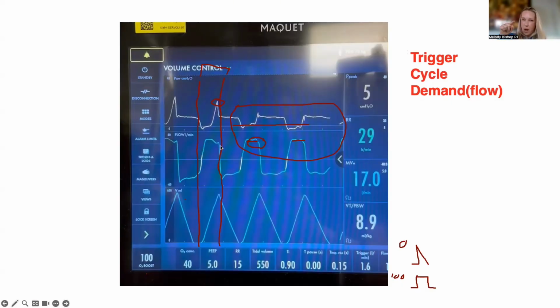Because to me, if it's a square and all of a sudden our flow is notching down, it could be because the patient is actively exhaling, decaying. Technically, I hate to say the word vector, but if you have the patient pushing the opposite way, it's going to give the overall resultant of less. Meaning the vent is used, like right here. Yes.